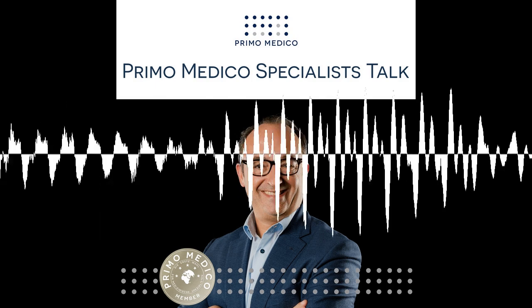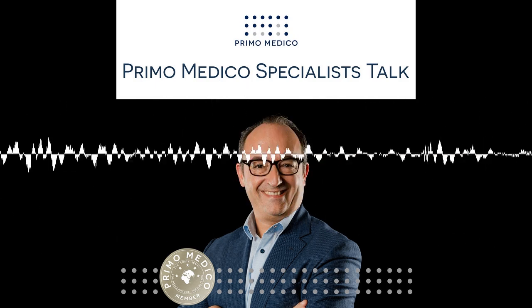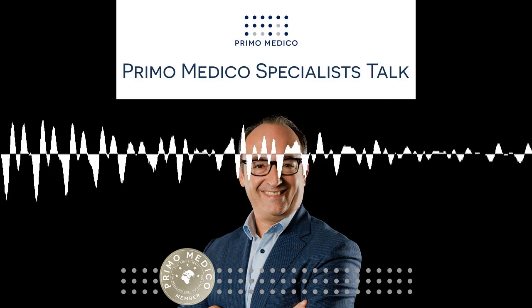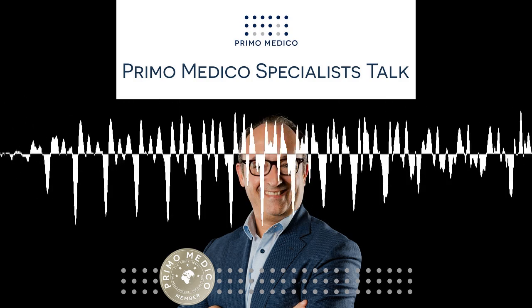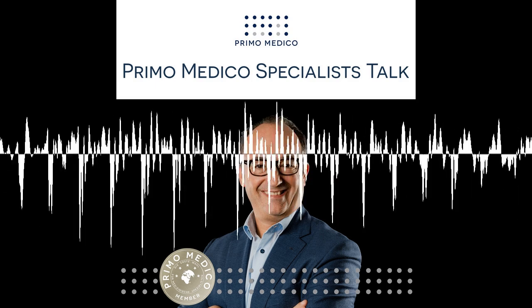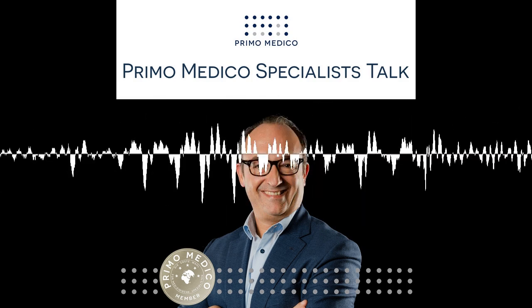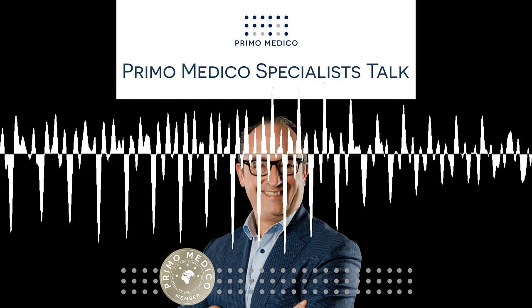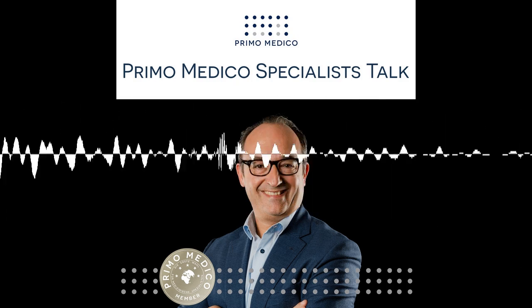Both of them reproduce a normal range of motion, reduce the pain, and improve quality of life. I personally recommend the mobile total ankle arthroplasty for more sporty patients and the fixed bearing total ankle arthroplasty for elderly patients. But nowadays it is still not clear in the literature which is better, the mobile or the fixed bearing. So future studies will tell us.